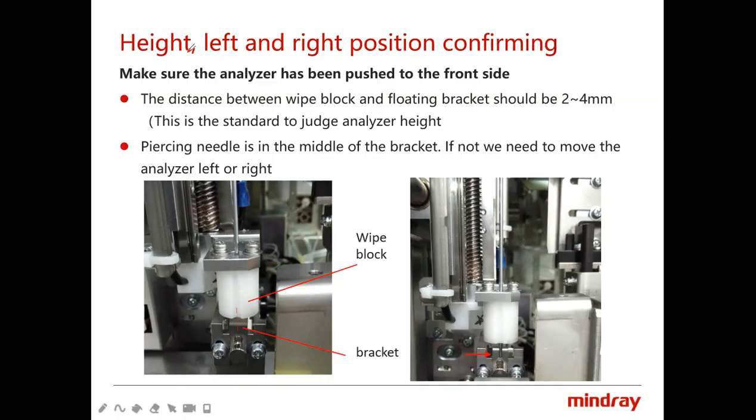And the height, left and right position confirming. We need to confirm whether the sample probe of the analyzer is in the same line with this bracket.